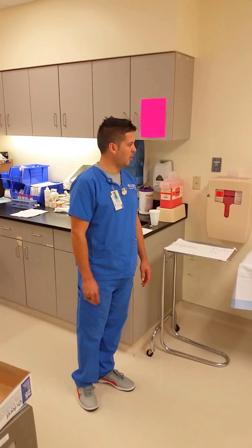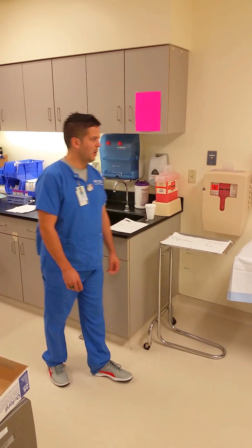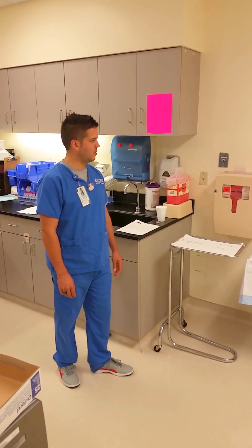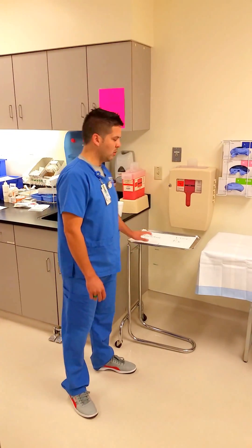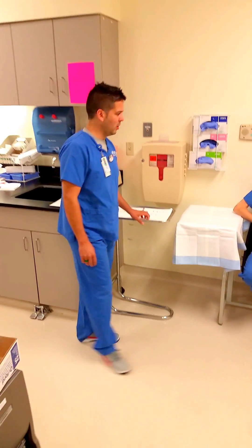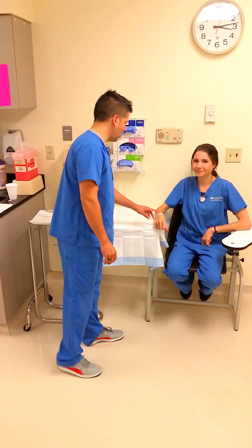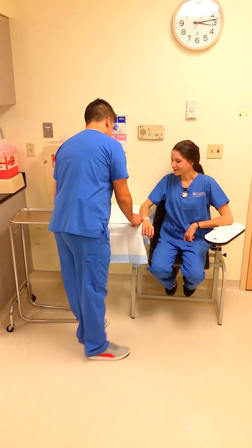So I've got my patient back into the department where we're going to do our thyroid uptake and scan today — specifically the uptake portion. I'm going to identify my patient three ways with the requisition that we print out as well. This is her actual order against her name band. So if you can tell me your name and your date of birth, please.